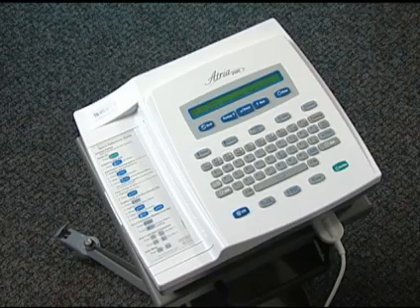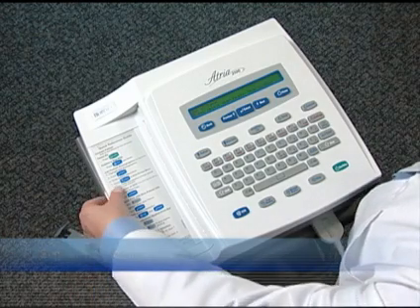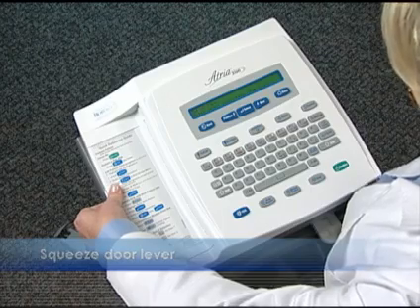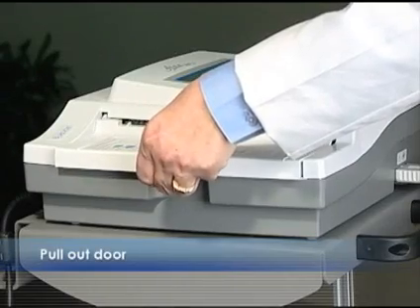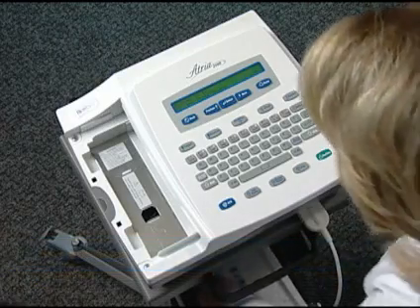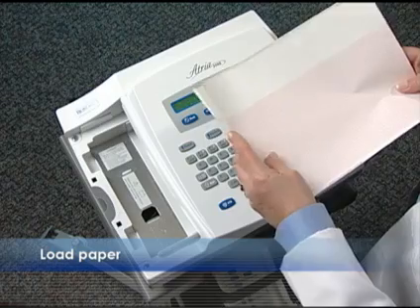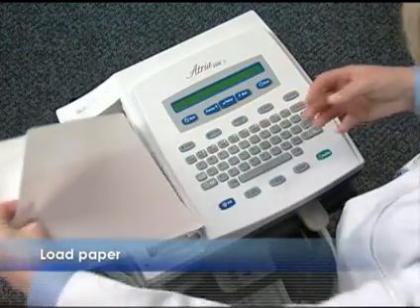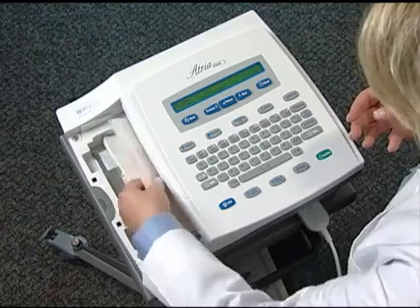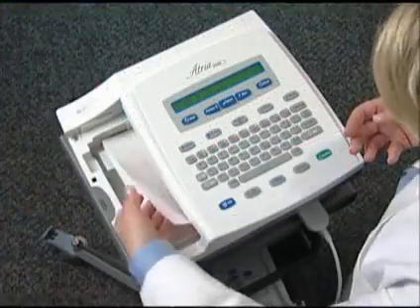To load paper, locate the paper tray door on the left side of the device. Squeeze the door lever in the middle of the tray until it clicks. Pull out the door and put it in a secure location to keep it from falling. Then load a stack of paper into the compartment. The black mark on the lower left corner of the paper should be facing up.